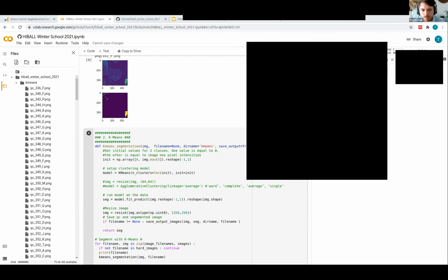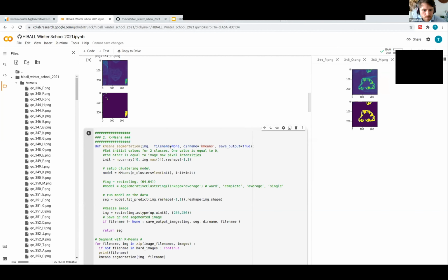If it's relevant, it'll probably be learned by the network in some way. But it could get weird if you have really extremely non-isotropic voxels. Even so, you would have to account for that in the pre-processing of your data. If you think that's a problem, you'd have to resample it. I think that's what I would say.